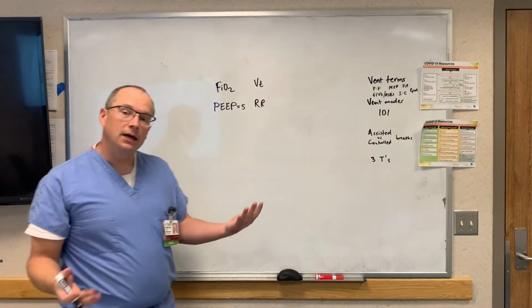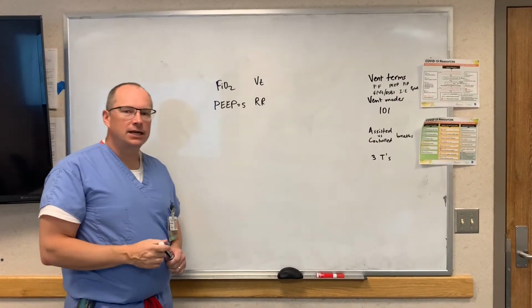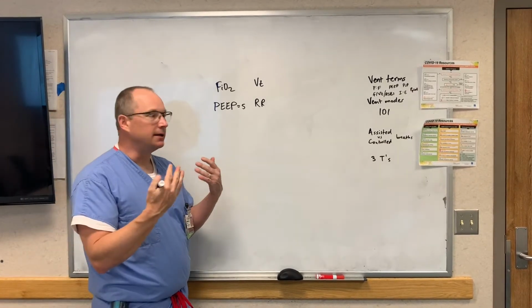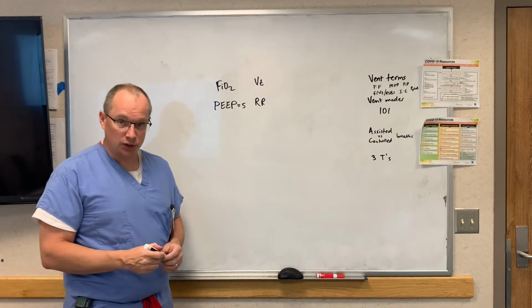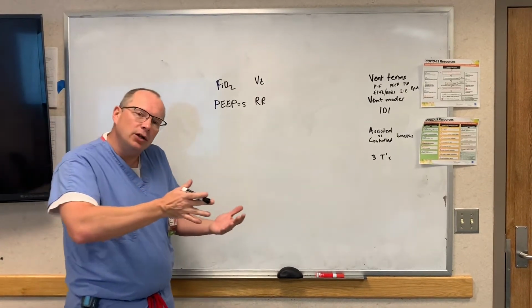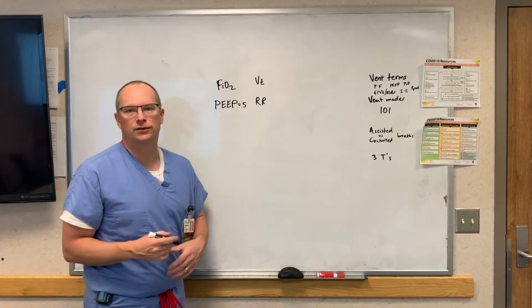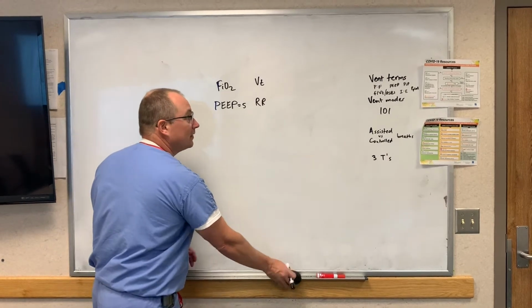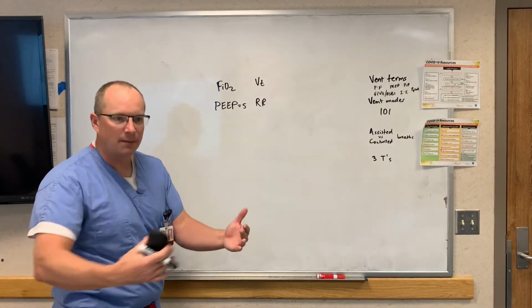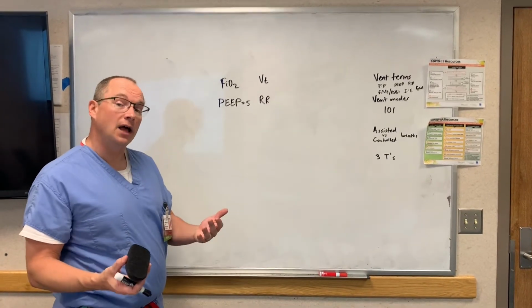Let's talk a little bit about vent modes. Like I said earlier, about 90% of the vent modes inside a medical ICU is going to be assist control or a volume control mode when you're giving full support. And then as you get closer to extubation or trialing extubation, then considering pressure support ventilation. I'm going to focus on those, but I'm mostly going to focus on assist control because many of the providers coming in to help with the surge are going to be dealing with assist control or volume control modes.